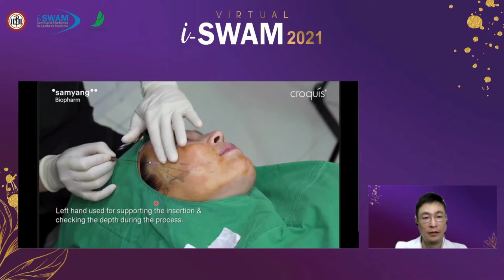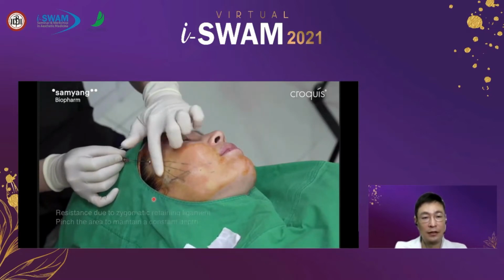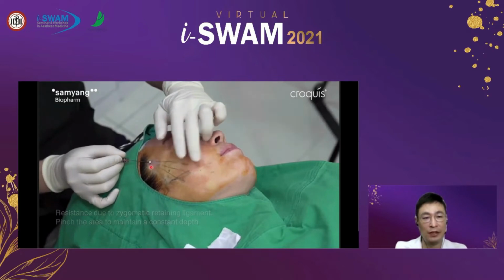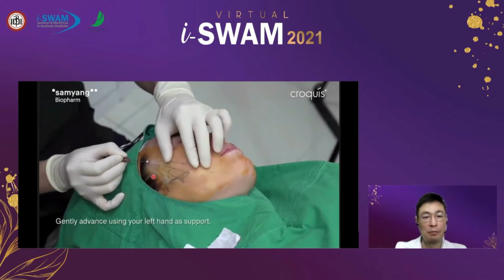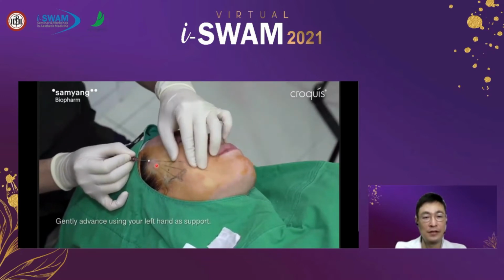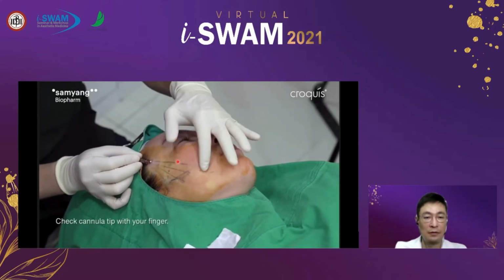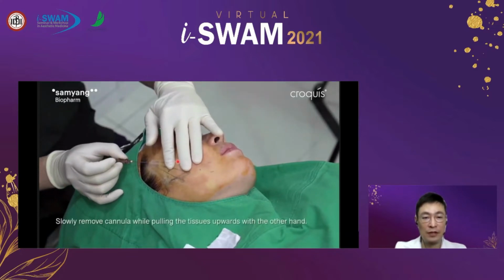Then, when you penetrate the dermis with the thread, you should advance at almost 0 degrees, that means very horizontally and almost parallel to the skin surface. In this area, there is usually a thick retaining ligament, the zygomatico-cutaneous ligament.